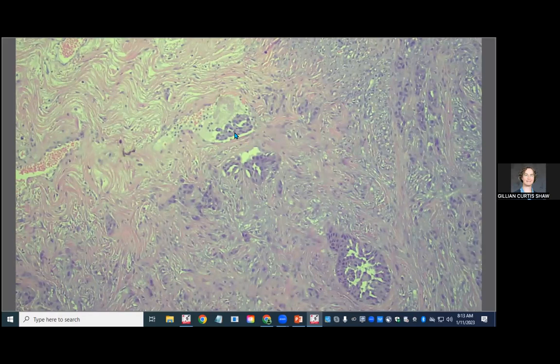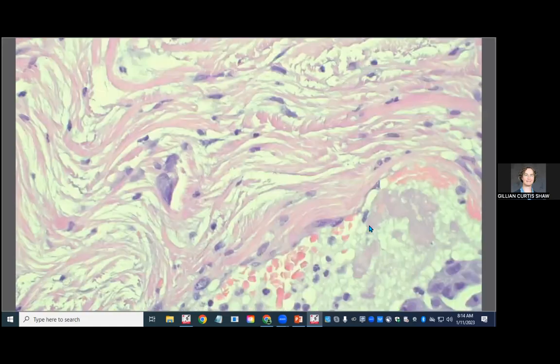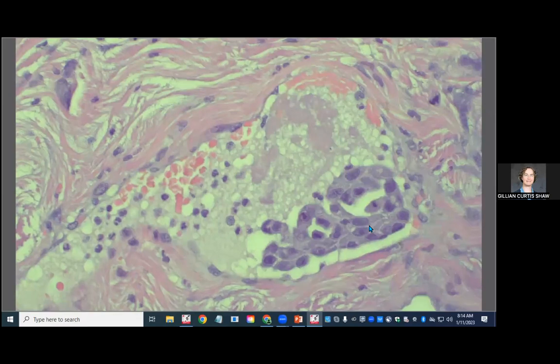I also want you to see this area up here, because they are floating inside of a vessel, which is never good. So here's our vessel endothelial lining. And then here's this nice little raft of cells that are floating on their own. This guy here has a mitotic figure. All right. That guy there has a mitotic figure. So these cells are malignant and going places.